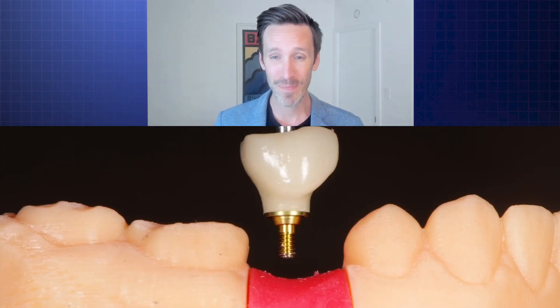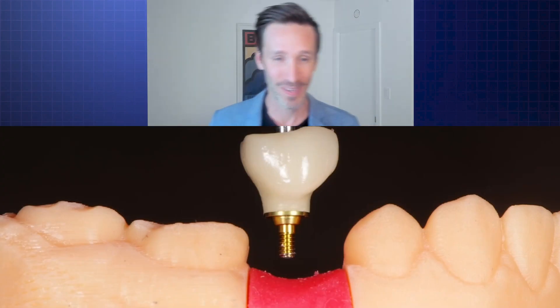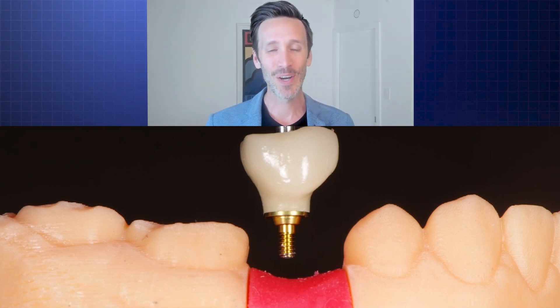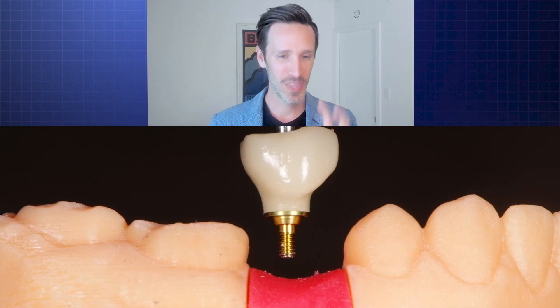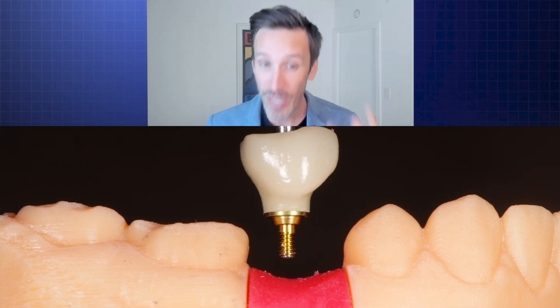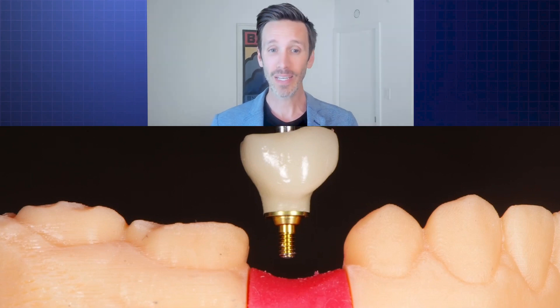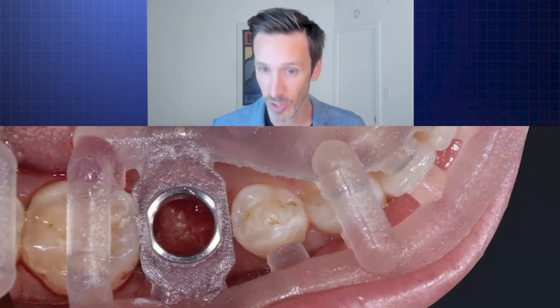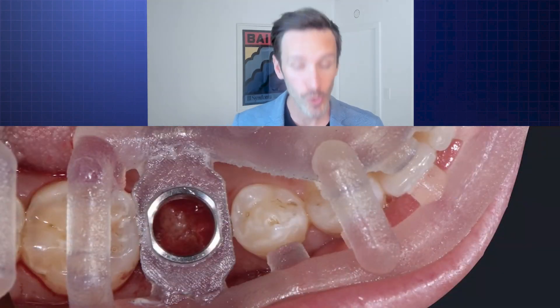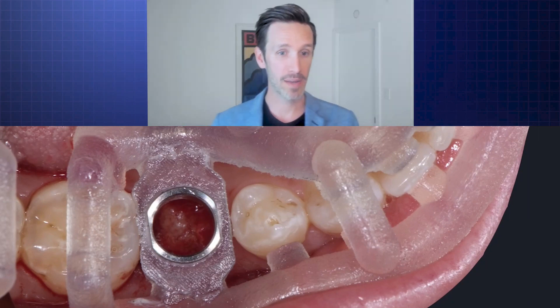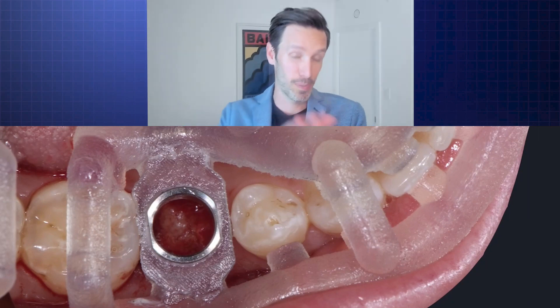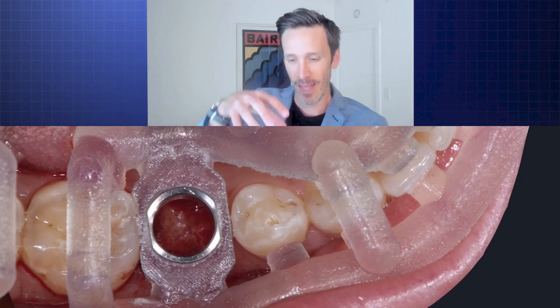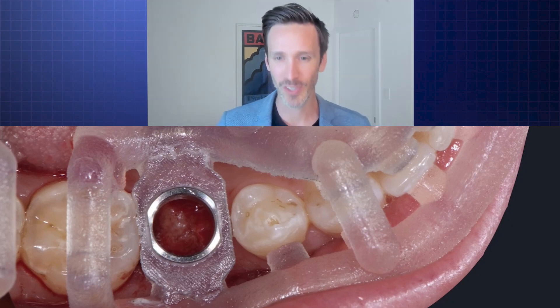Thomas Linkovicius and I attempted to do this in front of a group of people taking our zero bone loss course. Here we are with the printed guide, pre-fabricated temporary titanium abutment with a milled PMMA provisional. I extracted the tooth. We have some bone there right before we even started placing the osteotomy, because those baby tooth roots — there wasn't much there. So it wasn't like a traditional immediate placement.